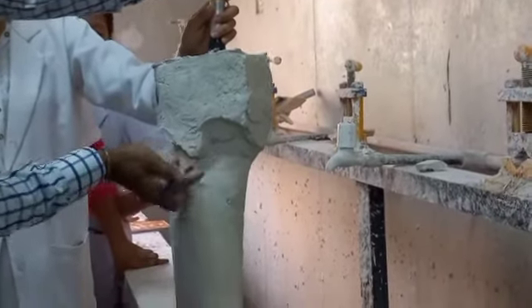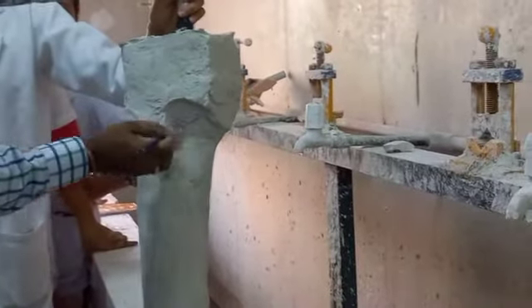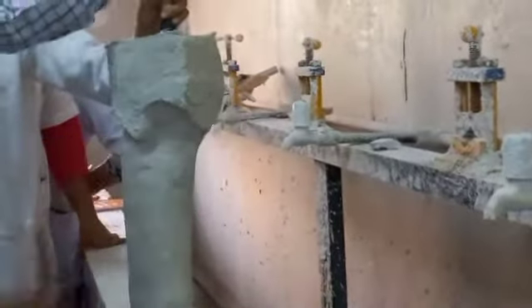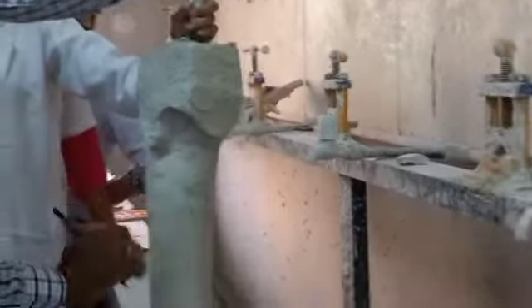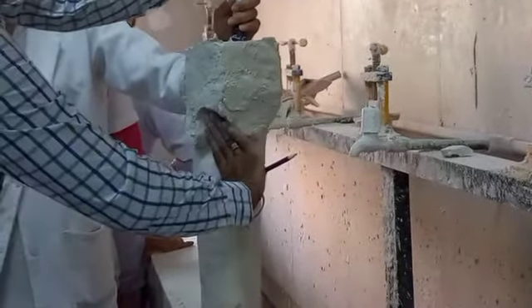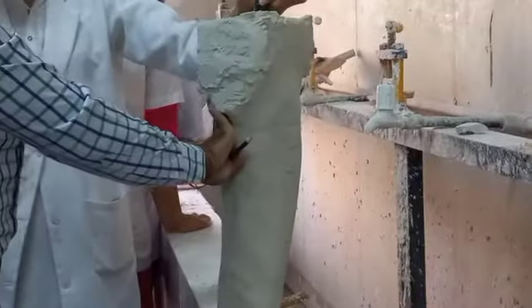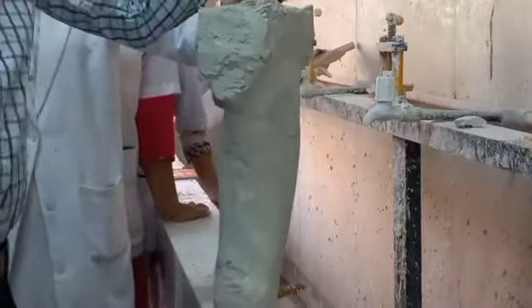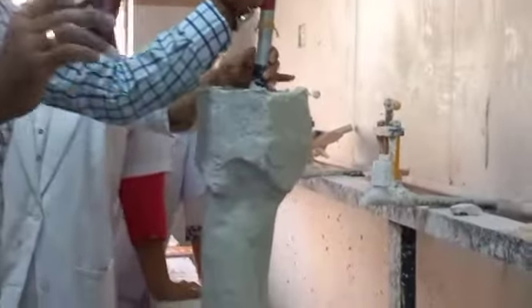So this lowest point is already being relieved. Okay. So this ischial area is being loaded by the bandage and by the primary person's pressure hand, the primary person's load. So this load is here. I hope it's clear. Overall, it's your practice, your interest. At least you know the principle of modification, that's important.